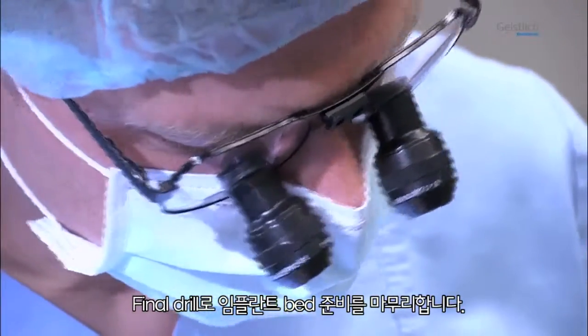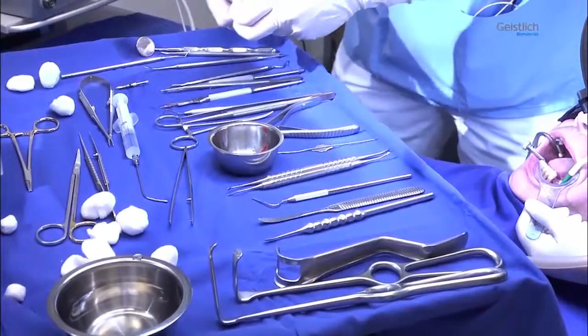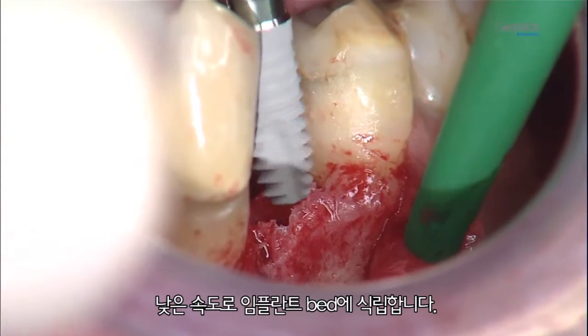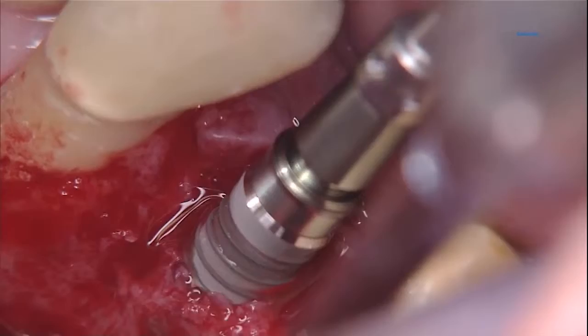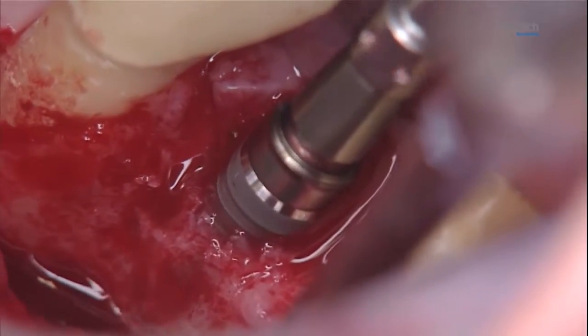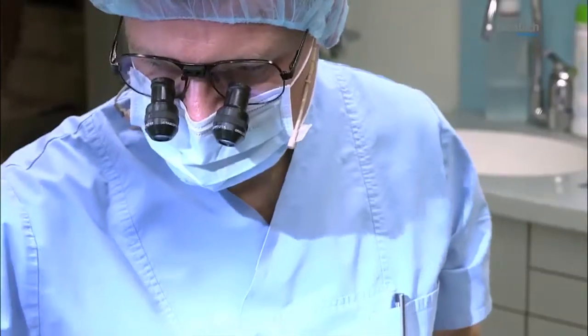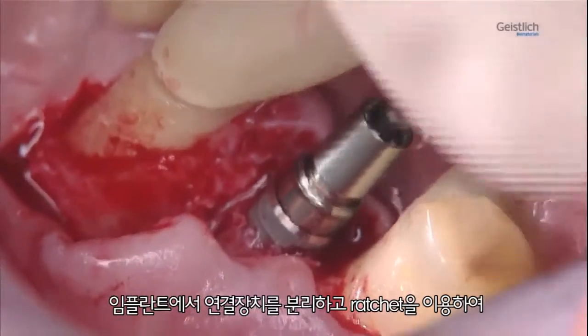We finalize the implant bed with a concluding round of irrigated drilling. The implant and its insertion tool are removed from their sterile packaging and mechanically screwed into the implant bed at low speed, following the implant manufacturer's instructions. We now detach the insertion tool from the implant.